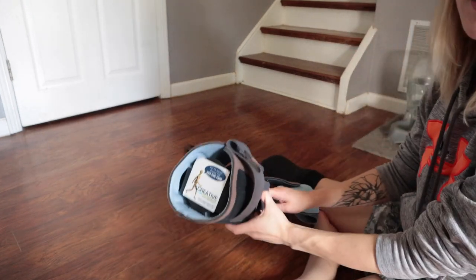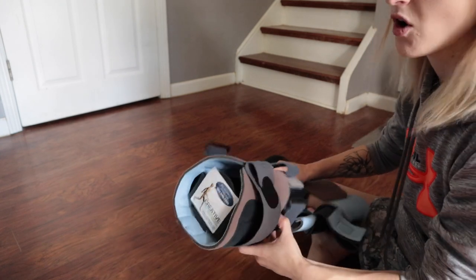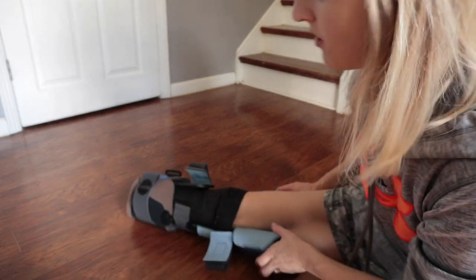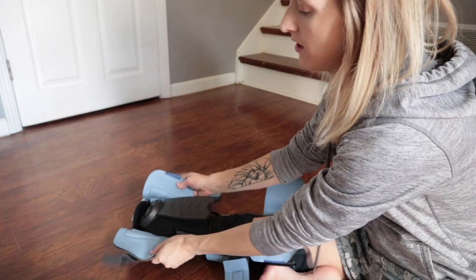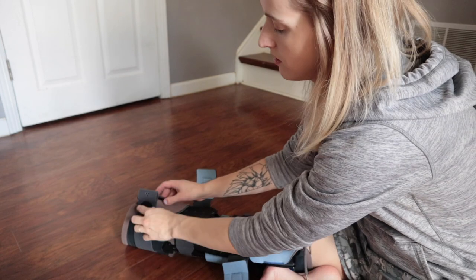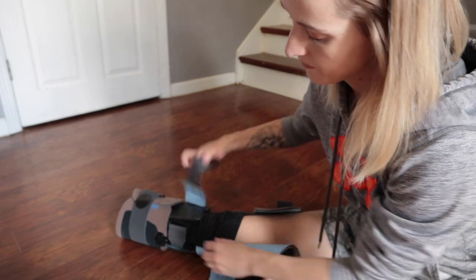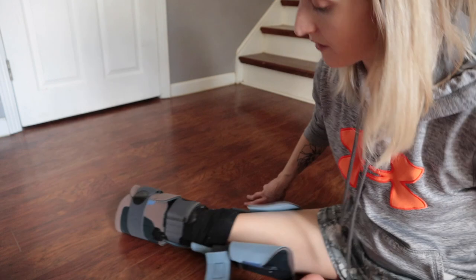So you'll see at the end here, it is really hard. That's to protect in case I fall and hit my stump — then I won't get as hurt. So I basically just slide it on like this. I'm going to start at the bottom and work up. It's important that it's tight, but definitely not cutting off circulation.